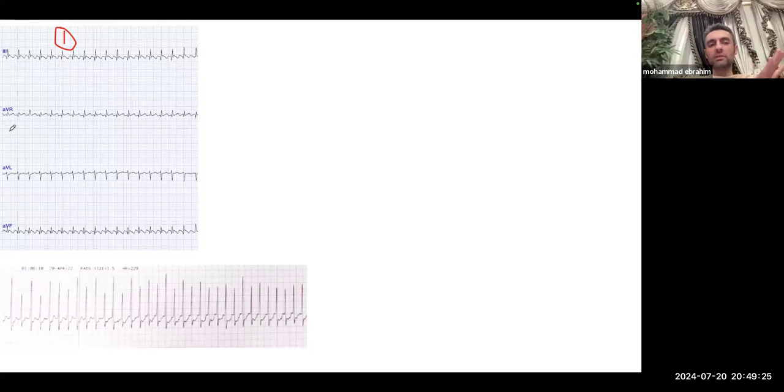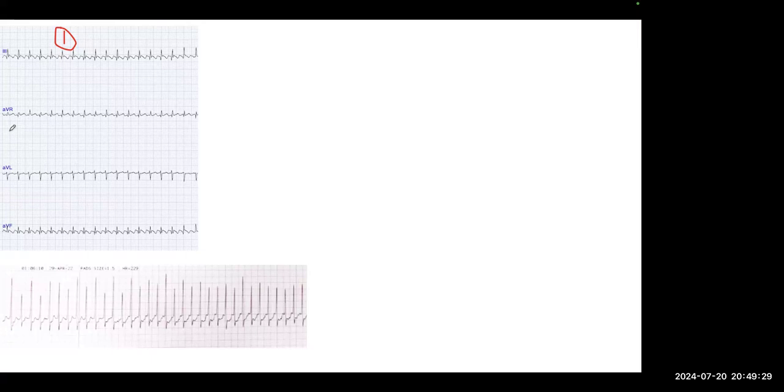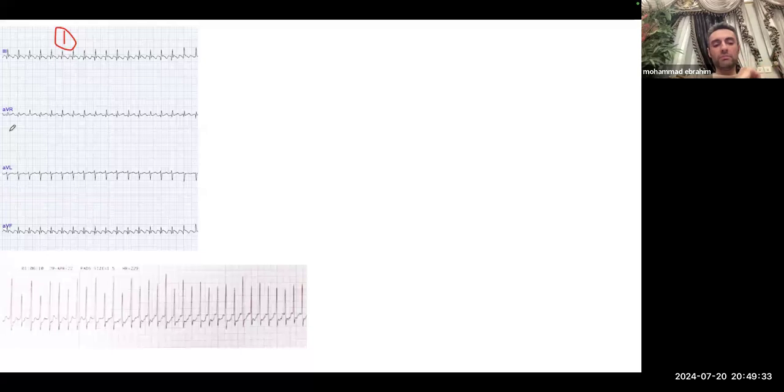It's a tachycardia, right? Narrow complex, not sinus, so SVT, period. Yeah, correct. Good. Everyone agrees?